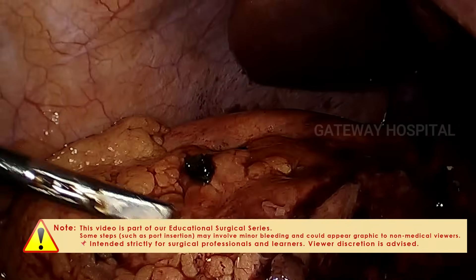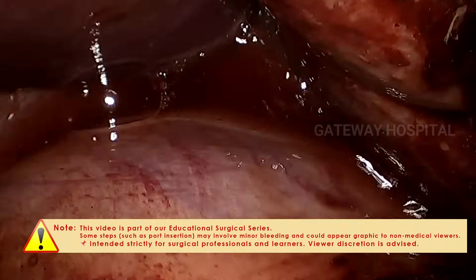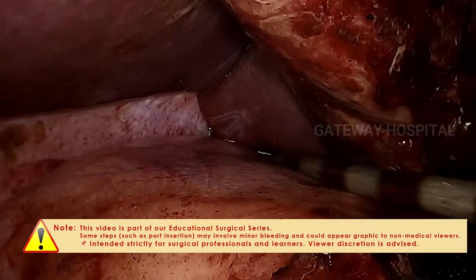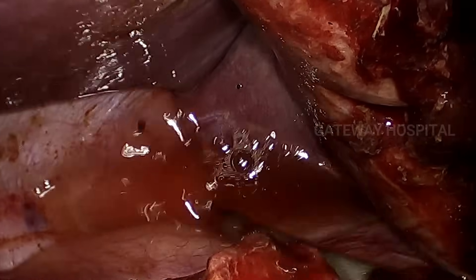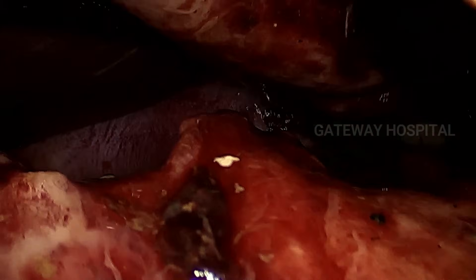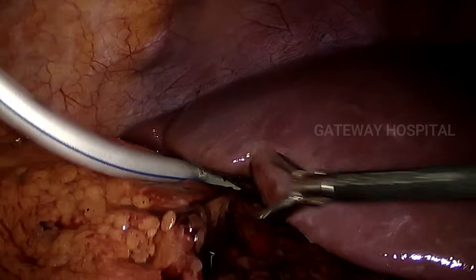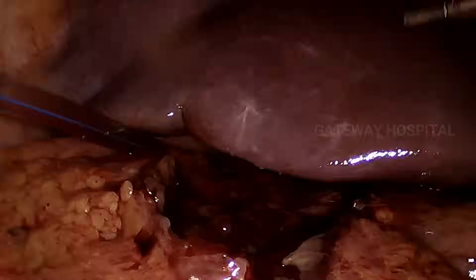We are retrieving all the stones and now giving the final wash before placing the drainage tubes. A 24 French drainage tube is kept close to the cystic duct. Thank you very much.